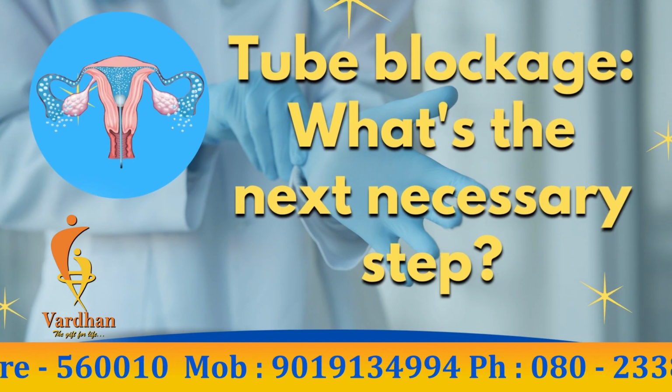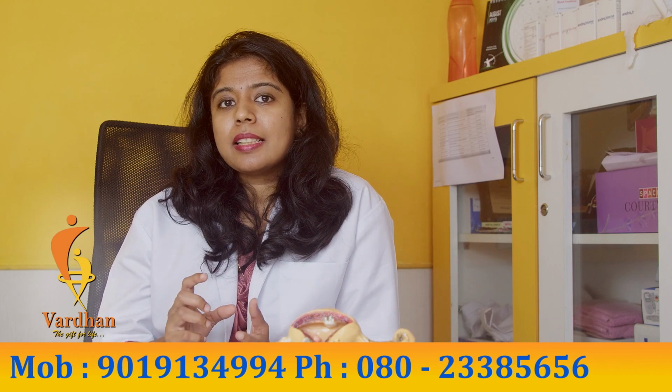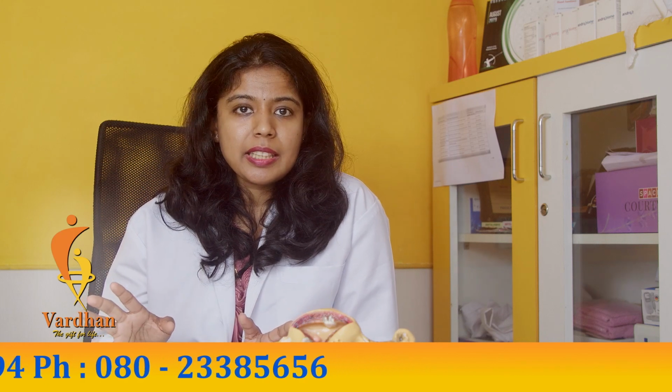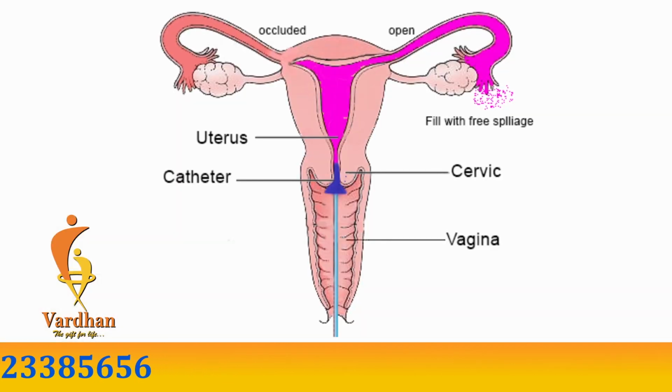Tube blockage. What's the next necessary step? So next would be, see, this test is like a screening test. It would not give you a confirmatory idea. Yes, if the tubes are open and there is spillage of dye, then you know for sure that the tubes are open. But if it is blocked, it doesn't mean that for sure it's blocked.